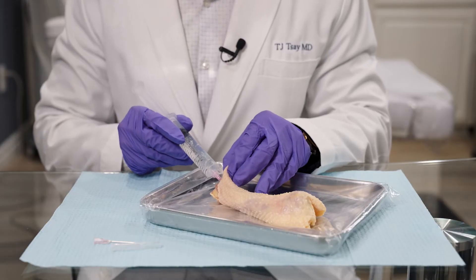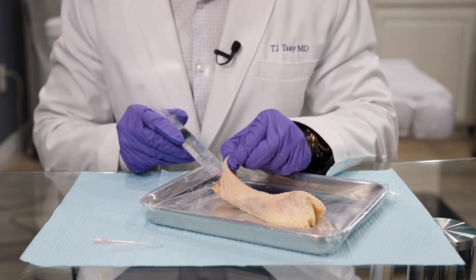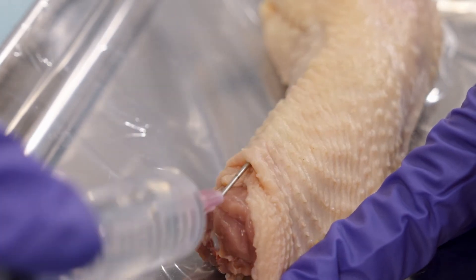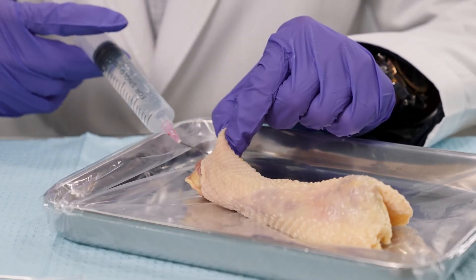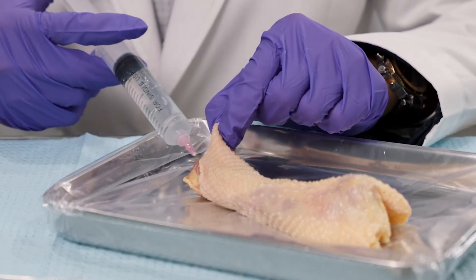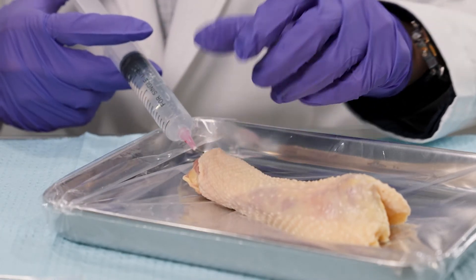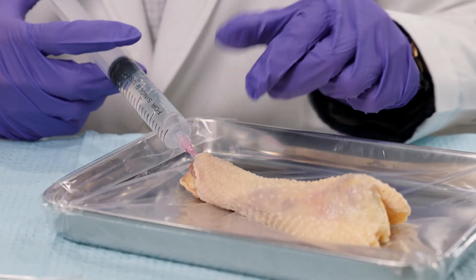The misconception people have is that we're injecting the filler or fat into the actual body of the penis, but in actuality we are only going underneath the skin. As you can see, the cannula is gliding in a very smooth fashion underneath the skin. We're using ultrasound gel here for demonstration, but we would be using either filler or fat — putting really small amounts, what I call little ribbons of product, along the shaft in a very uniform and smooth manner, because we want it to be nice, smooth, and symmetrical with no irregularities or bumps.